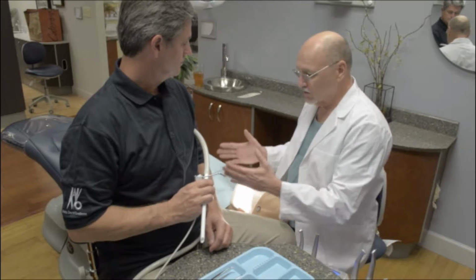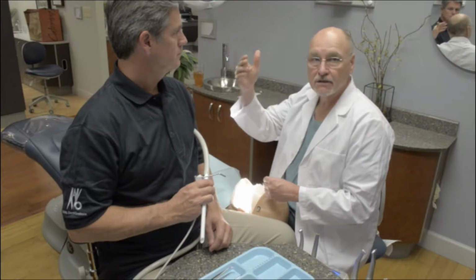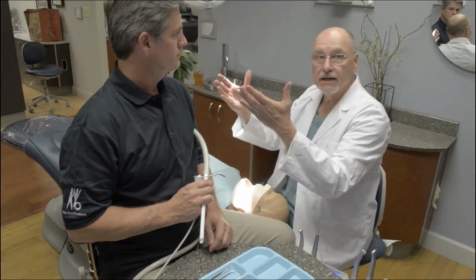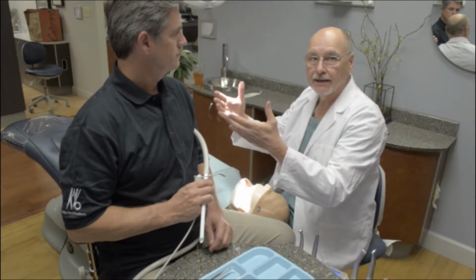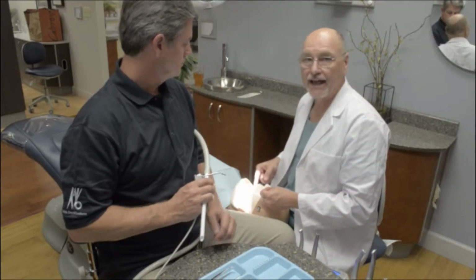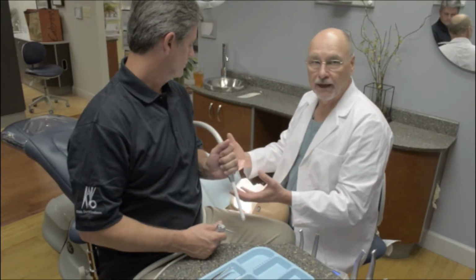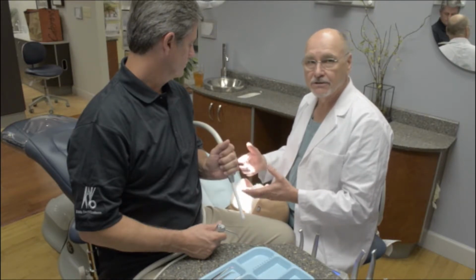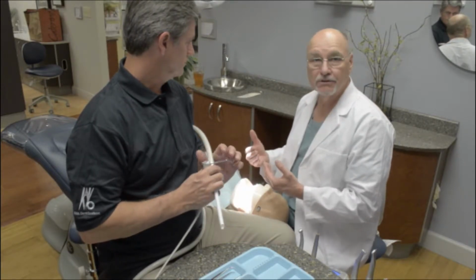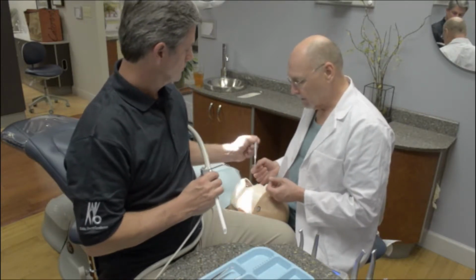So we have a horizontal coordinate. The vertical coordinate for our assistant is that we want the eyes of the assistant 6 to 8 inches higher than that of the doctor's. And indeed, his eyes are substantially higher than mine. This positioning allows the assistant to look straight down into the oral cavity, have a channel right into the oral cavity without having to lean over or bend at the trunk at all. And the advantage is they see what you're doing. Once they know what you're doing and when you're doing it, then they're able to deliver the appropriate instrument at the exact right moment, just in time, so to speak.